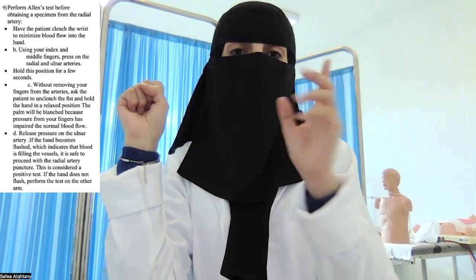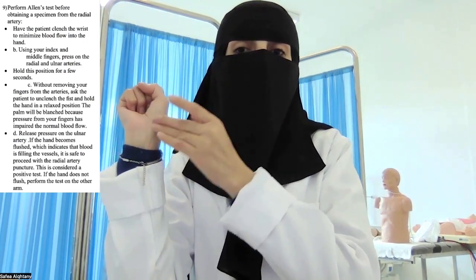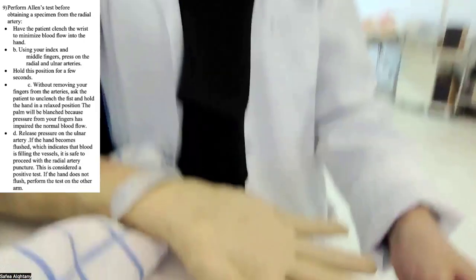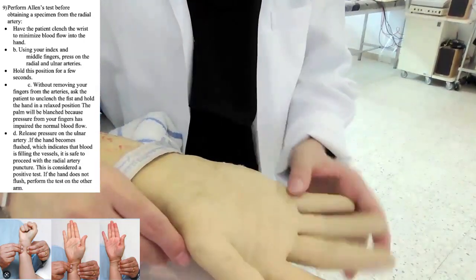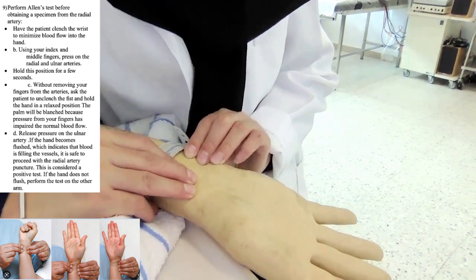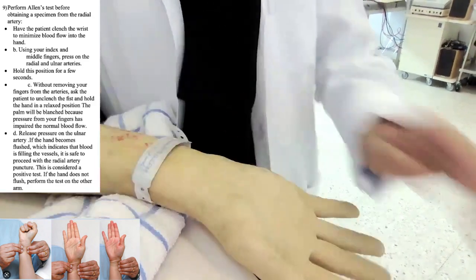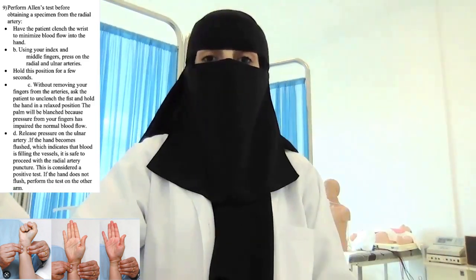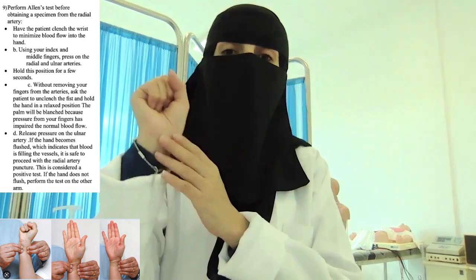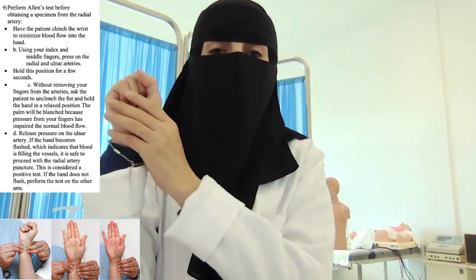Then me, the healthcare provider, I will apply pressure using index and middle finger to the radial and ulnar artery. يعني أضغط في المنطقتين كاملة like this. طبعا نفترض إنه هذا المريض مسكر يده ومعامل قبضة، أنا راح أعمل ضغطة بالشكل هذا using index and middle finger. أضغط طبعا على منطقة ulnar and radial artery for 30 seconds، يعني not more than 30 seconds، لأنه ما أبغى أوقف blood circulation على الطرف.